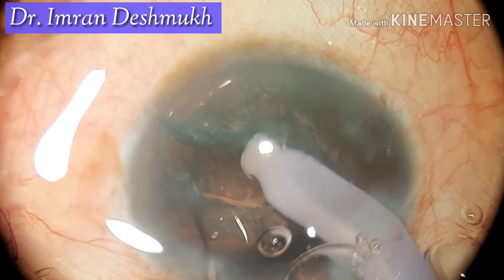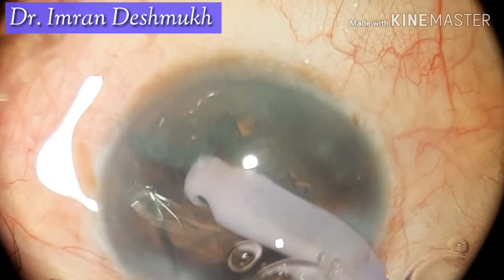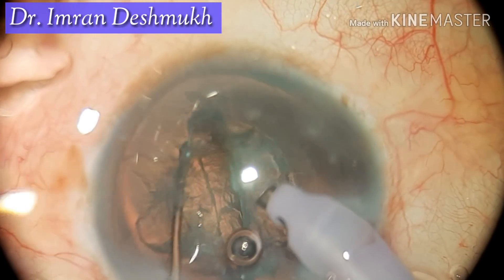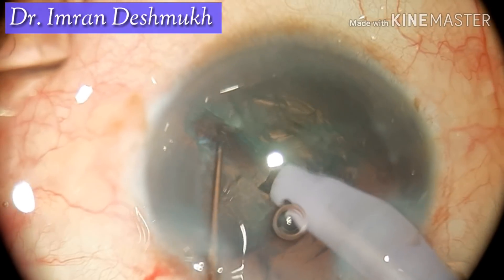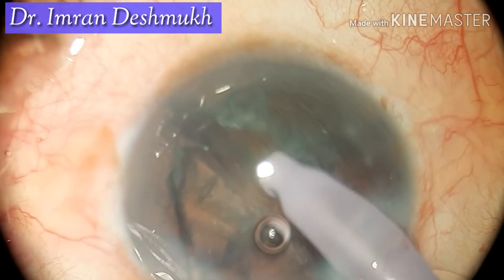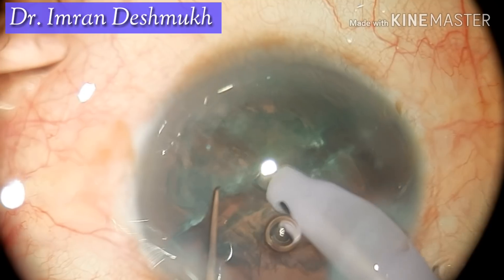Don't go too deep. Once the desired depth is reached, I try dividing, but I'm having problems dividing. So what I do is rotate the nucleus again and go towards the other side. I slowly trench and put both the phaco tip and the sinskey hook in to try to divide. Here I get a partial divide, not a complete divide.